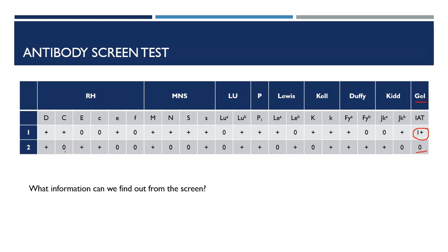And here's where you do have to put your blood group system knowledge to use. Remember, big D does not have an antithetical antigen, so if it's present on a cell, we can go ahead and cross that one out. I like to use double crosses if I'm crossing out on a double dose cell versus a single dose cell. That's just an old habit.